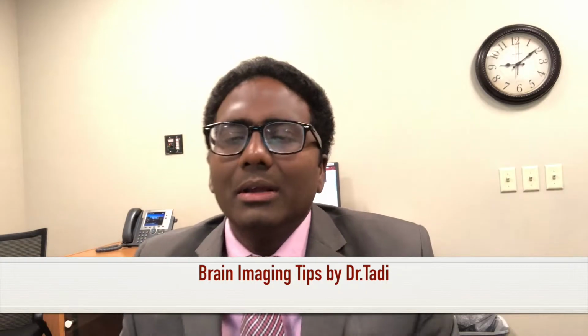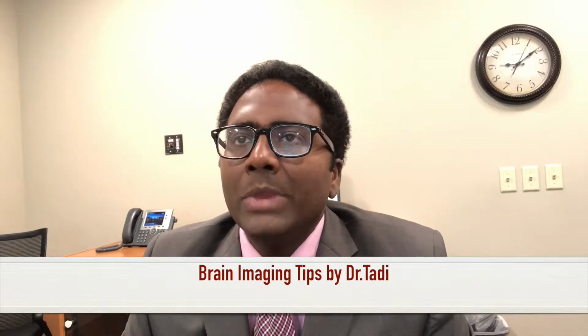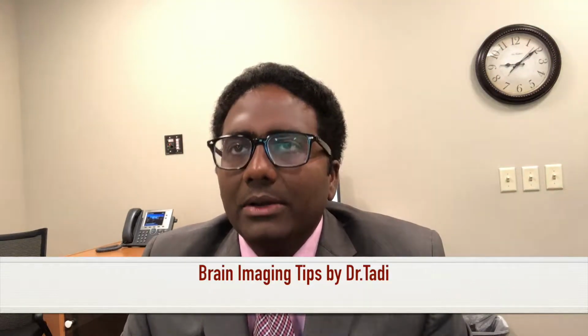So neurology consists of mostly looking at head CT and MRI. So you have to master this skill. The easiest way to master this skill is having an organized approach, as I said, organization. So always look at the normal side first, symmetry.